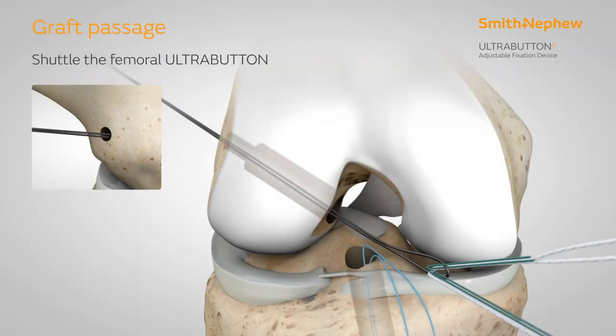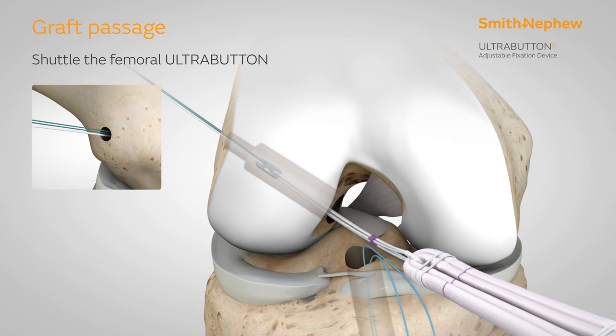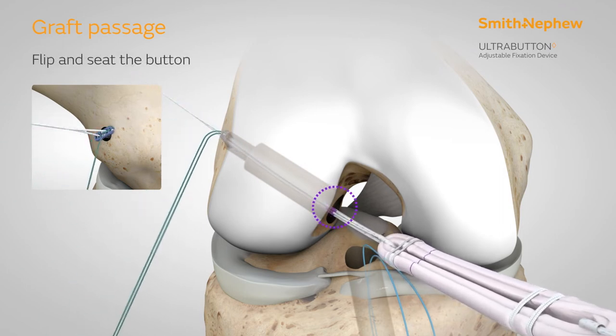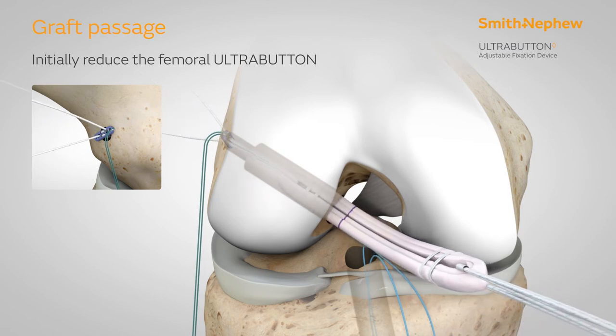Shuttle the ultra button's green and co-braid sutures through the femoral tunnel, then pull on the green suture until the mark on the sutures is at the socket aperture. While holding counter-tension on the graft, pull slightly past the mark to flip and seat the button on the cortical wall. Initially, reduce the femoral ultra button by pulling on the co-braid sutures while holding counter-tension on the graft, stopping short of the full socket depth marked on the graft.